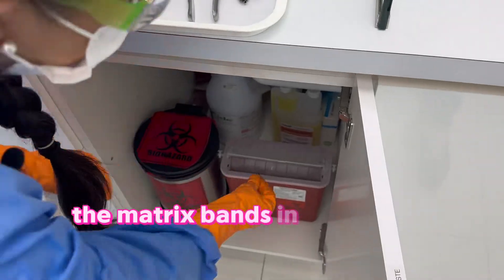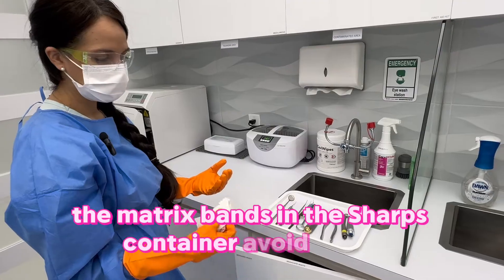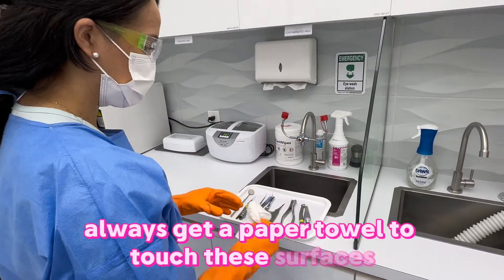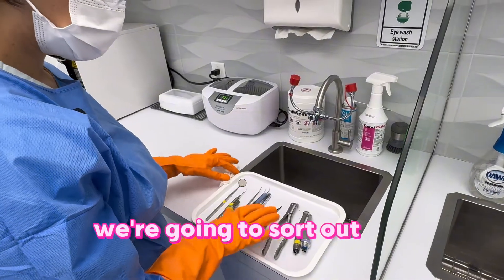The matrix bands go in the sharps container. Avoid cross contamination — always use a paper towel to touch these surfaces. Now we're going to sort out the instruments.